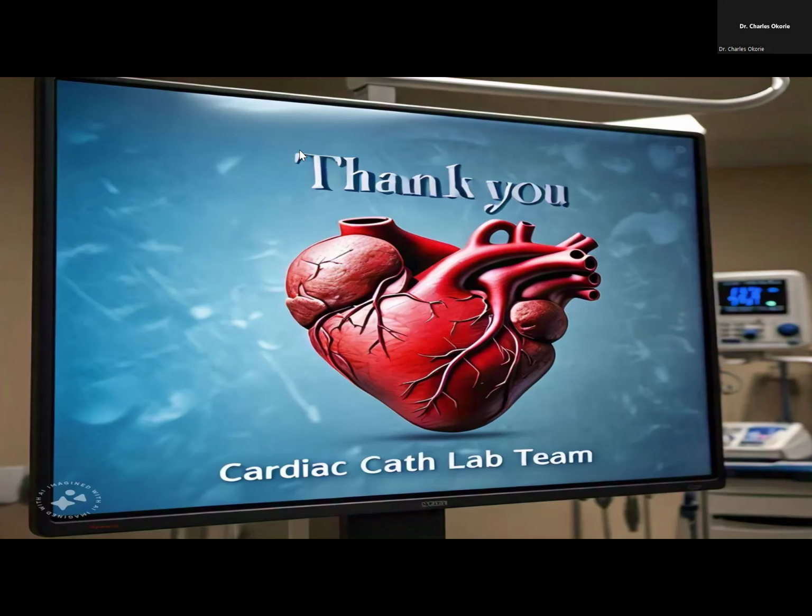There's a separate catheter to image the left main, that's the left circumflex and the LAD. Then there's a pigtail, the one for left ventriculography, which is used to assess ejection fraction and regurgitation. So there are different catheters that assess those different things.